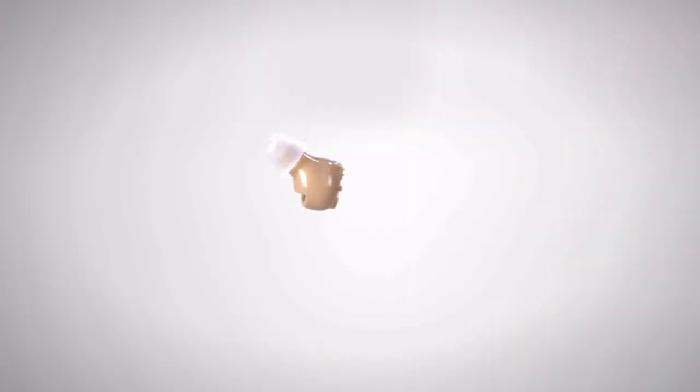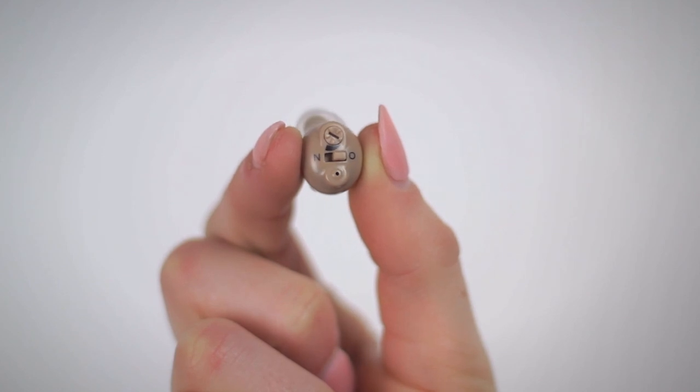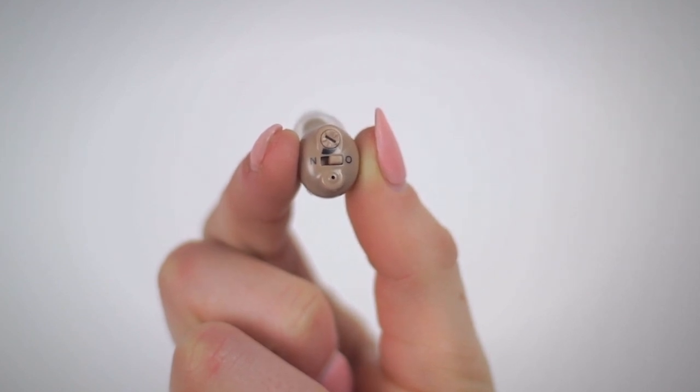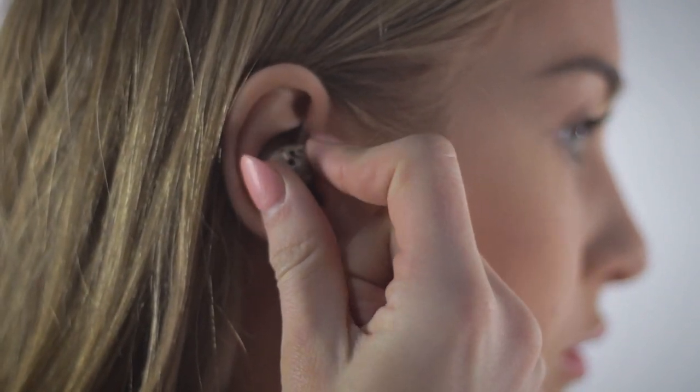We understand that using new hearing aids can be a stressful process. Remember that it's expected for your device to not feel normal for the first few weeks. Focus on using your hearing aids every day for a few weeks and you'll be acclimated to the device.